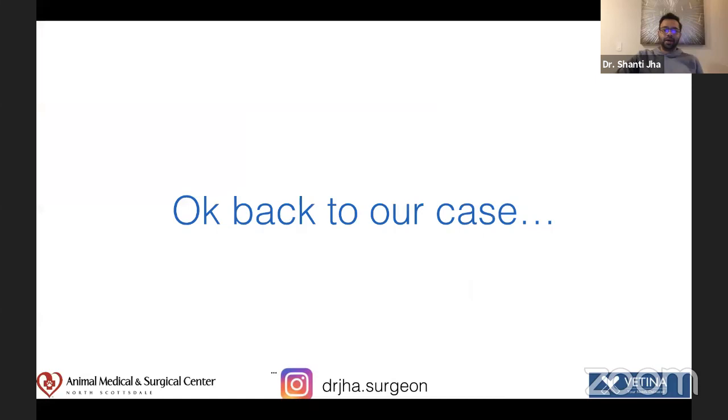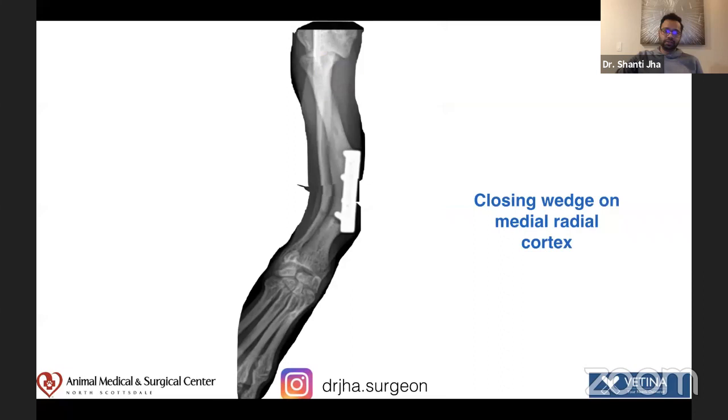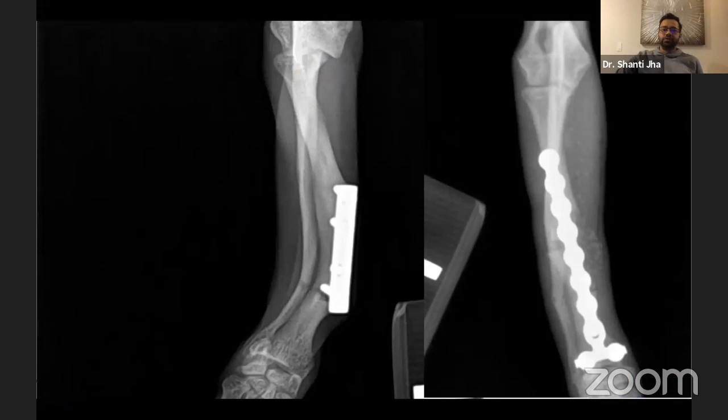All right, back to our case. So this is what I did. I measured, did some math. Math is important for life, I guess. So I corrected the deformity. I knew that I had to do a medial closing wedge correction. So I took a triangle out. There you go. And then made it straight and put a plate. So this is the post-op right here.